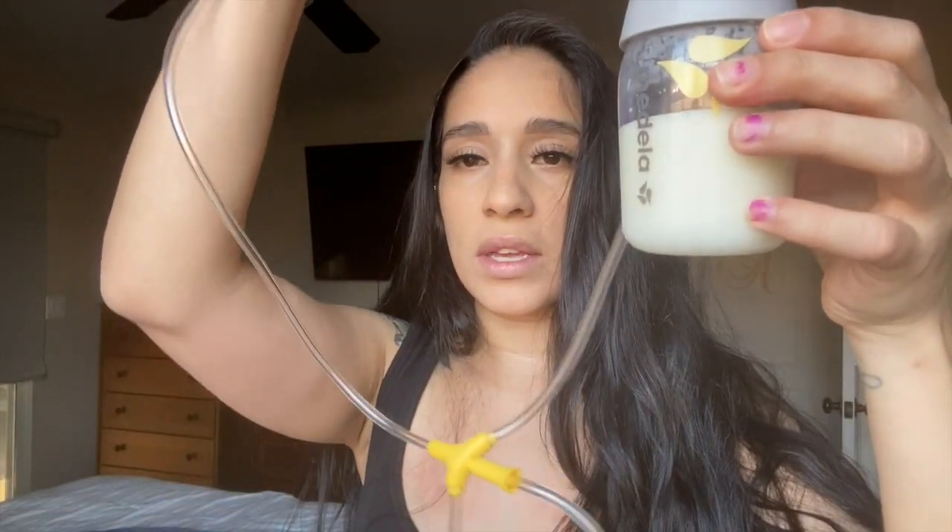Okay, so this is pretty much how you assemble it. I do one side at a time, but this is what it looks like assembled.